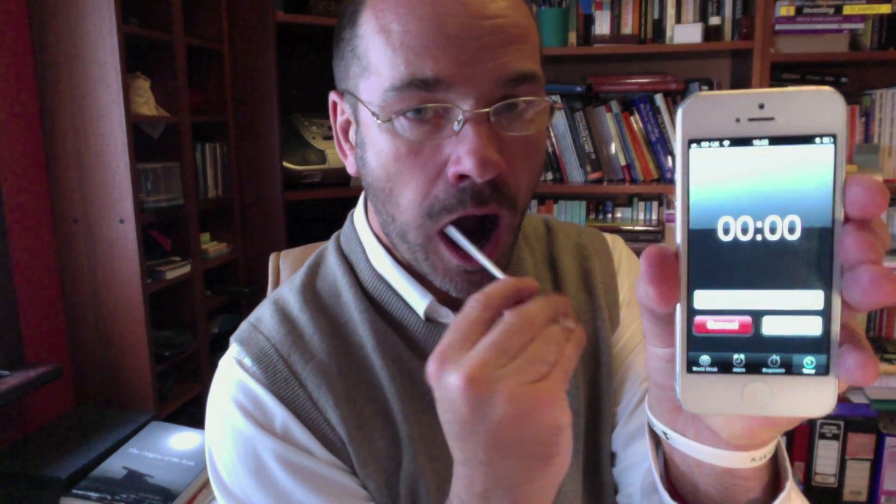The next step is to swab your cheek for approximately 45 to 60 seconds. I have my timer here beside me and I'm going to set that for one minute. So that's my cheek swabbed. Now I need to transfer the swab into the bottles provided.